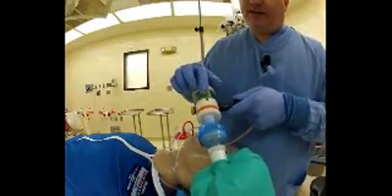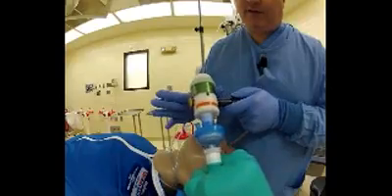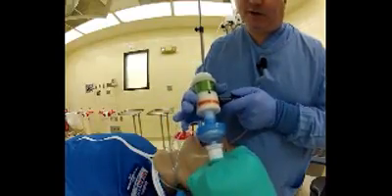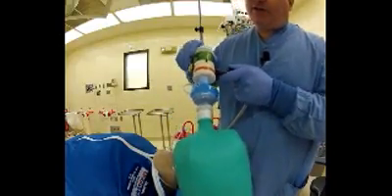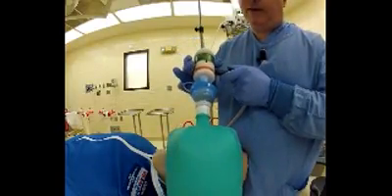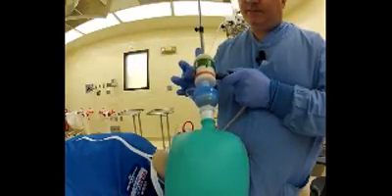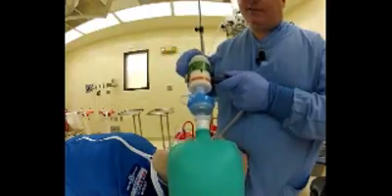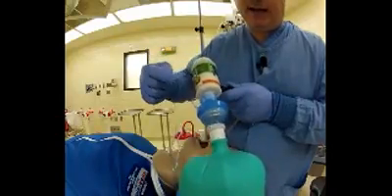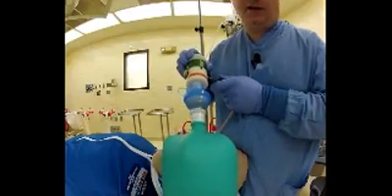I've set the pressure release on the oxalator to 15 centimeters of water. If I continue to hold that O2 release button, the inspiratory phase will stop upon achieving 15 centimeters of water. I've gone to 20 centimeters of water, now 25 — the bag gets bigger and bigger with higher pressures. That's 30 centimeters of water. What I'm going to do now is put on the automatic mode, where I lock the O2 button down. As you can see, the oxalator is ventilating this test lung autonomously.